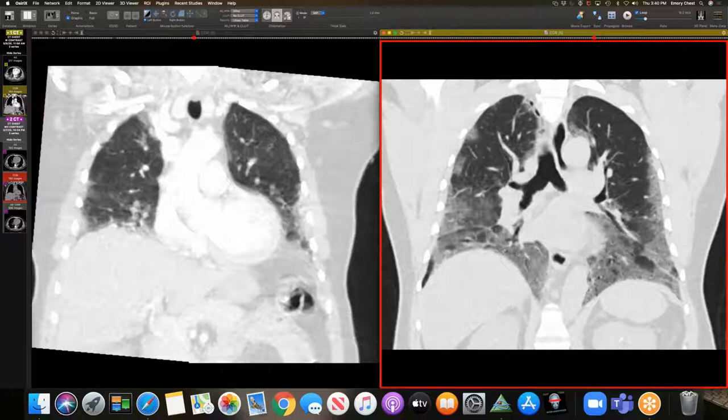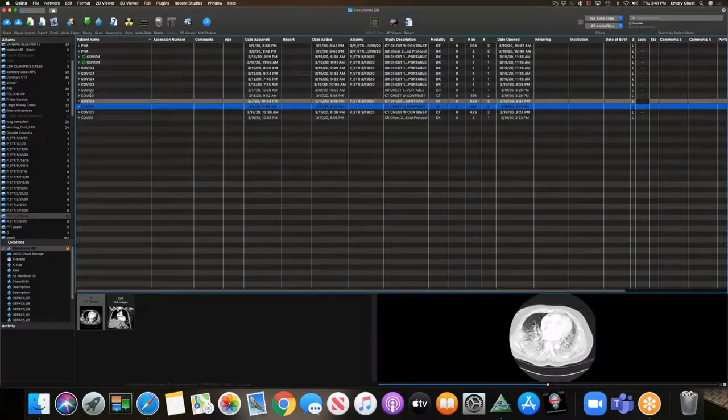Yeah. Well, and if you have a high pretest probability, the CT is still moot unless there's a complication, because they're going to get quarantined. Exactly. And ruled out another way. Exactly. How old is this person, Peter? Mid to early 50s. But just to show, this is actually kind of interesting.